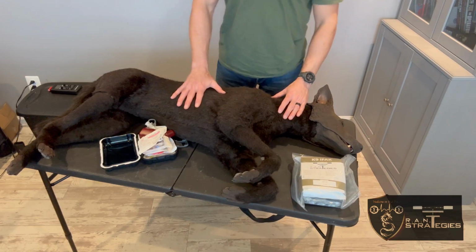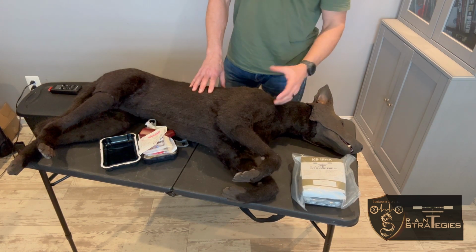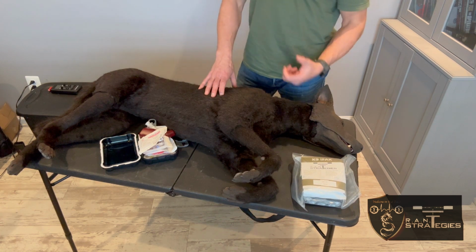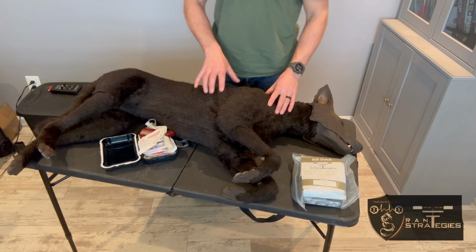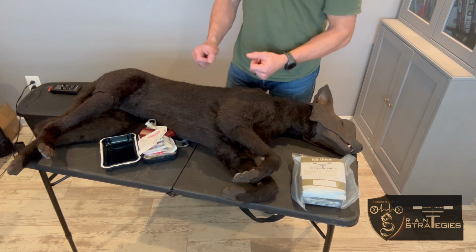Okay, so we have our sick or injured canine here. He's going into shock. We tried getting IV access on him. We were unable to, so he's in circulatory failure. So we're going to go the IO route. The first thing we need to do is ready our equipment.